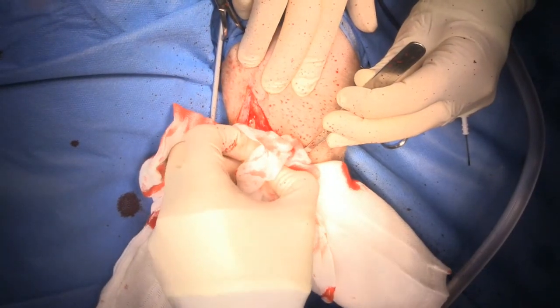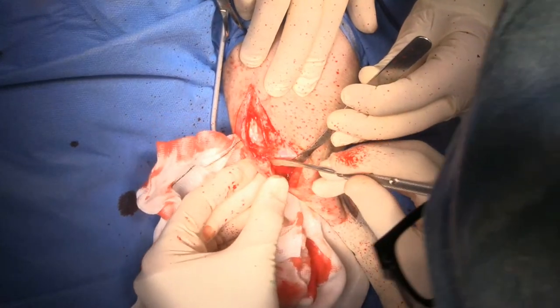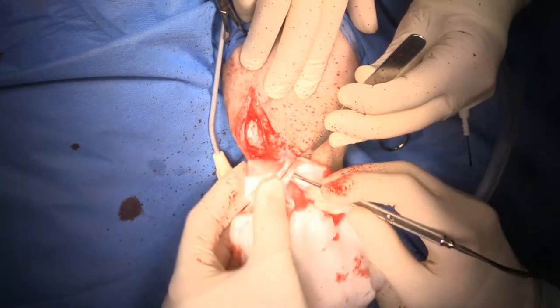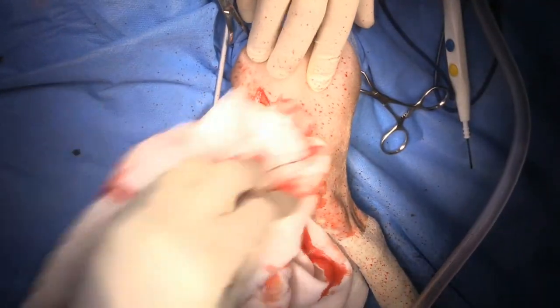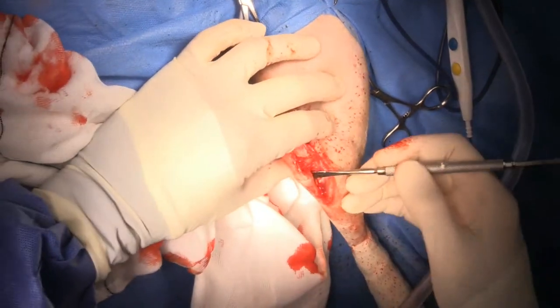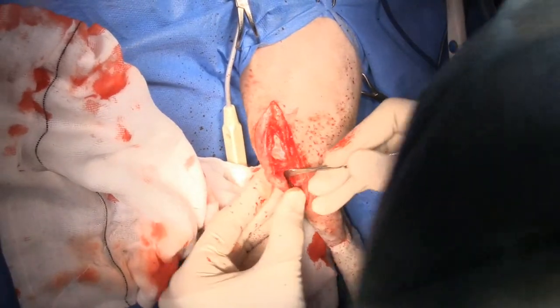I've gone almost all the way down. Then I'll take my freer elevator - if you listen closely you're going to hear a little pop. That's when I'm breaking that distal bone but leaving the periosteal attachment intact. Now I'll remove this, grab a towel clamp, and move the crest over, making sure it's completely released.